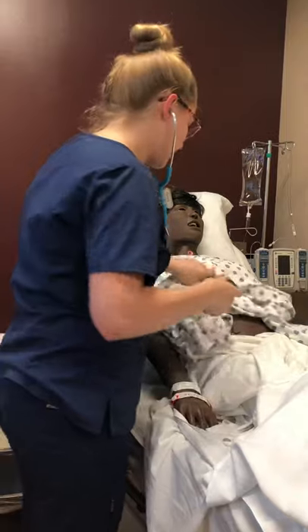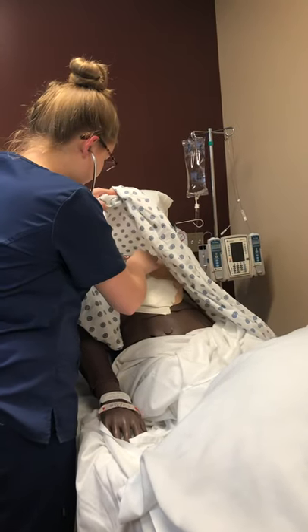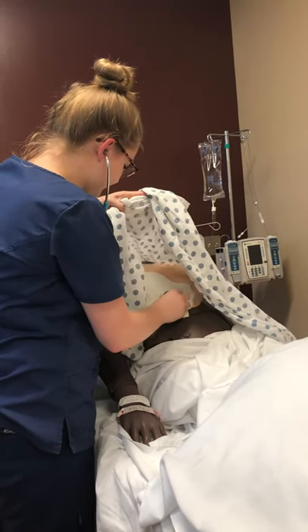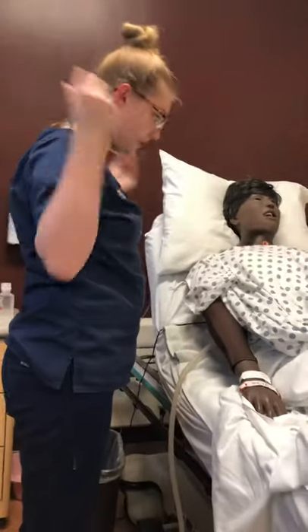I'm just going to pull up your gown here. Just breathe nice and deep for me. Mary also does not have any pursed lip breathing, which is good. So everything there sounds good.